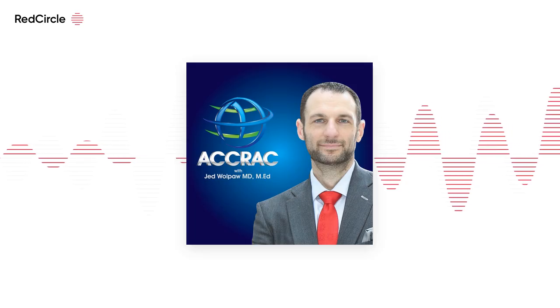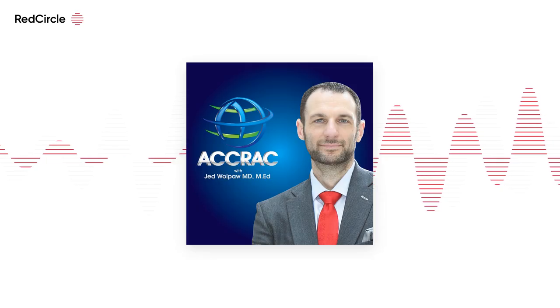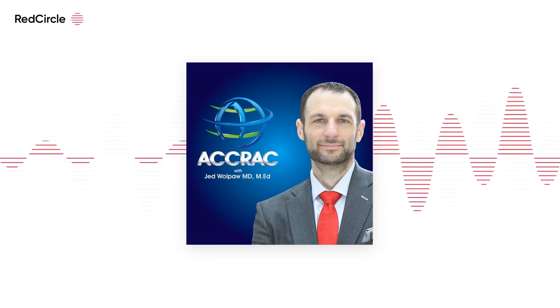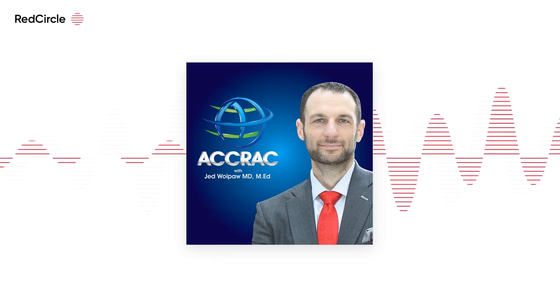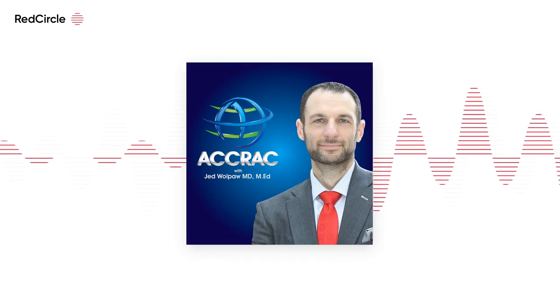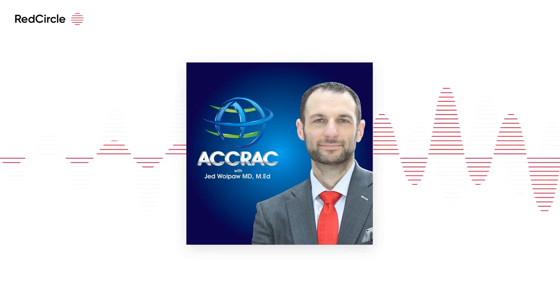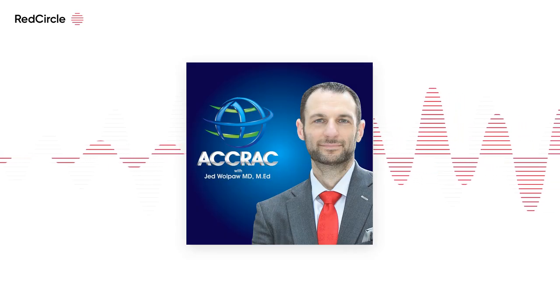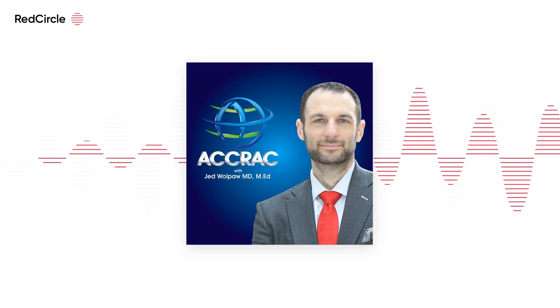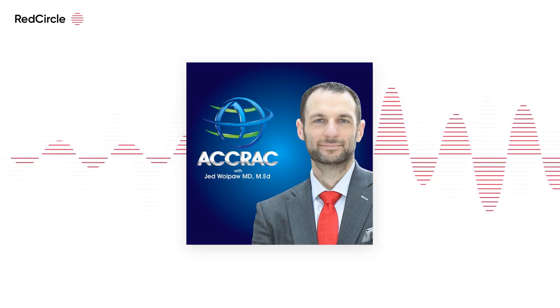And they're like, okay. And they're like, how will I know if it's good or bad? I'm like, well, chances are everything's just going to get better. You might have to turn down your pressure control after you turn up your PEEP. And that's exactly what happened. As we turned the PEEP up, the tidal volumes got higher. They reduced the pressure control, turned the FiO2 down. Like I always say, if you're going to use esophageal pressure, when you start using it on an obese patient, it is like a magic trick. I would say 95% of the time, it's like you're performing magic.